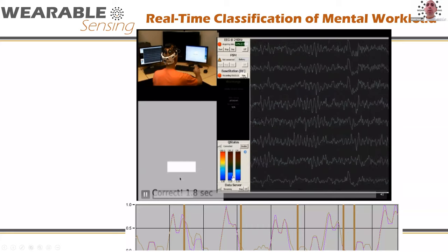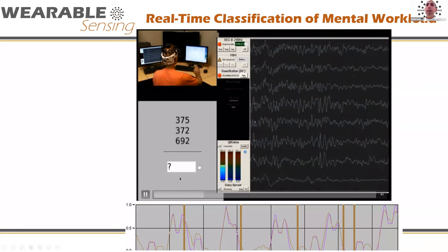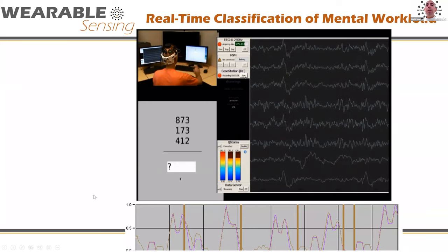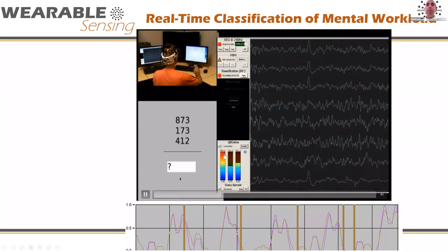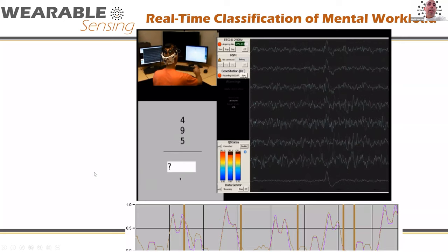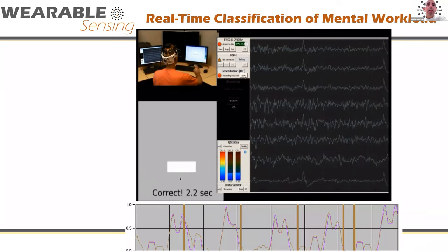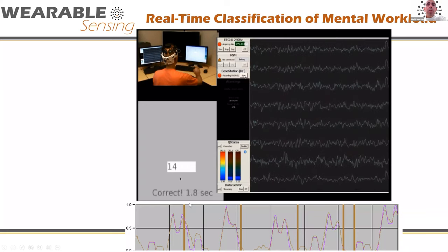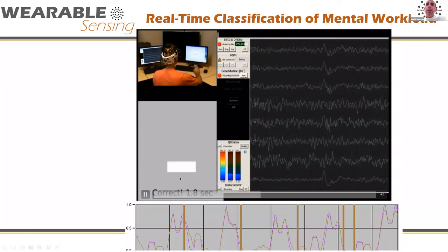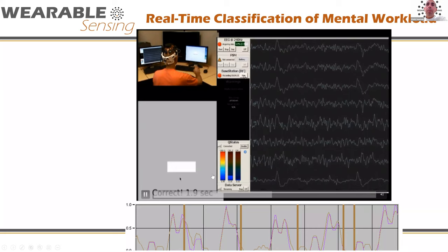The first column is engagement — this person is highly attentive with a high engagement level. The next two bars are workload. He's solving problems quickly, not concentrating a lot. Then it got hard — his attention went down, engagement dropped, and his workload started going up. He got it incorrect — most likely due to his loss of attention. Now he's paying attention again; his workload is going up. It took him 13 seconds and he got it correct. You can see that if I were just looking at the EEG, I'm not going to visually discern whether he's thinking hard — that's why we need machine learning to interpret this EEG data.